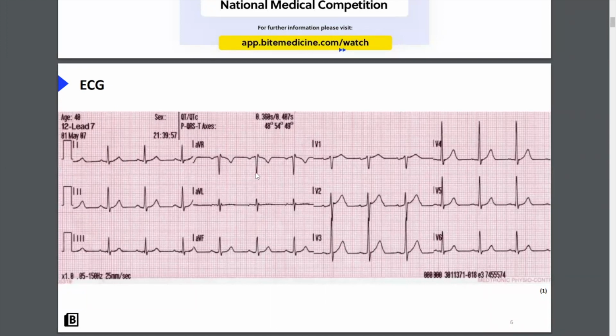The next point: is this normal or abnormal? That's always the first question you need to ask yourself in medicine, if it's an X-ray, if it's an ECG, if it's a blood test. So is this normal or abnormal? Okay, so we've got some normals and we've got some abnormals, but there's T-wave inversion here, yeah? So is that normal or abnormal? I'll ask the question again.